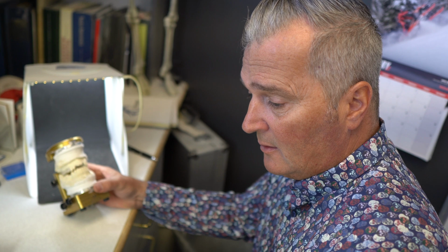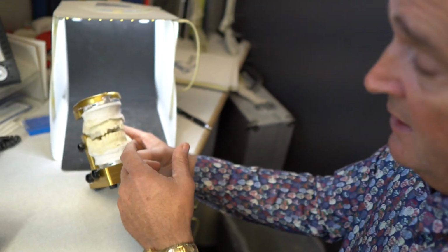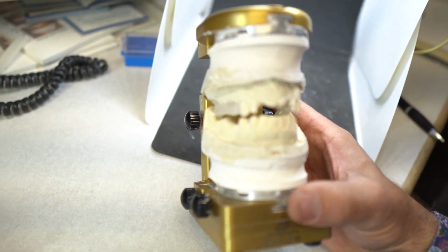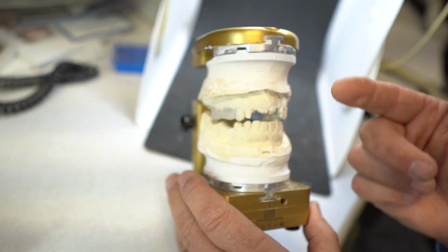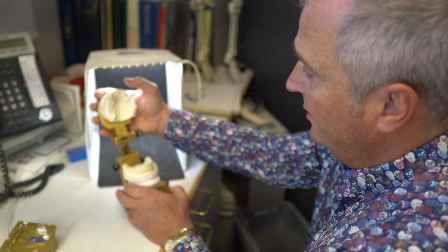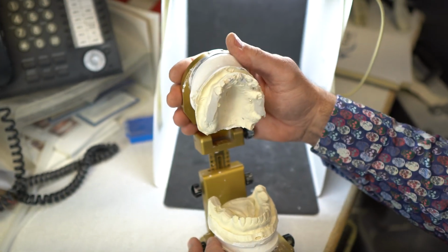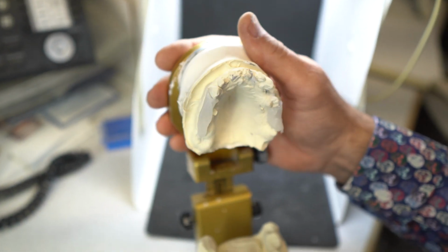So that's DENTA4 with application. Whether you've been to phase 1 or phase 2, this is marrying these two things together in real life. This could have been a bridge, you know. Maybe this just happened to be going to be a partial denture, but this could have been a precision attachment case, keying off of these two cuspids, and then making attachments.